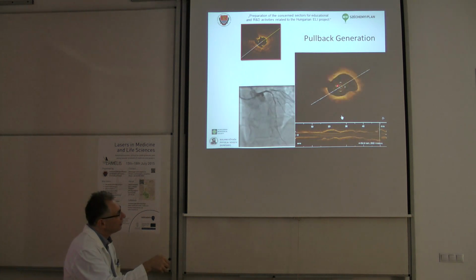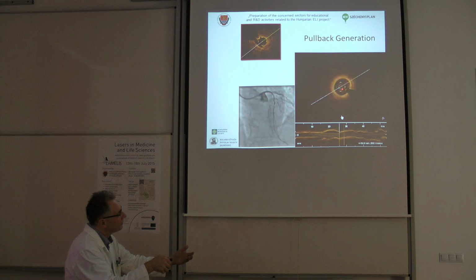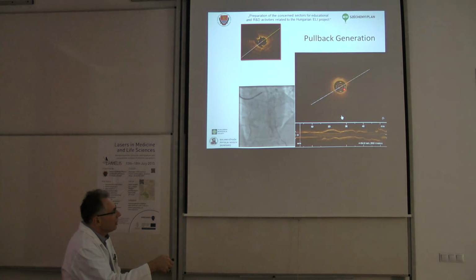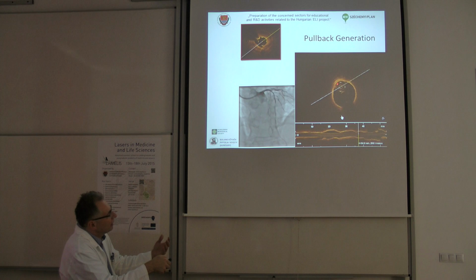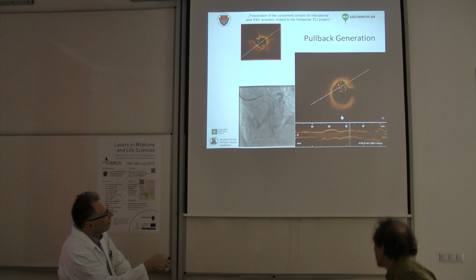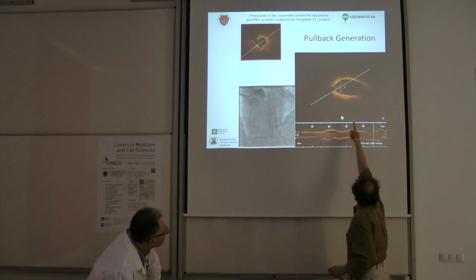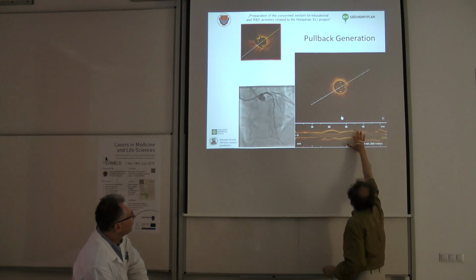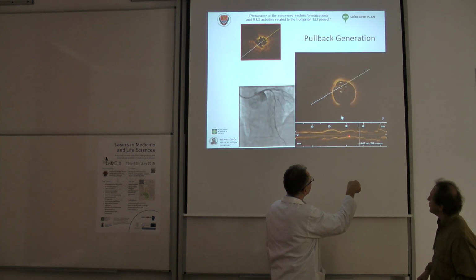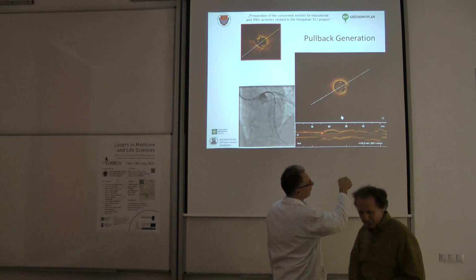So this is the plastic sheet, which is transmittable for the light. You cannot see the probe because the probe generates the image. The outer surface is marked, but it's electronically marked as a post-processing step. This is the tissue which you see here. And these horizontal lines are the outer surface of the plastic. This is the inner surface of the plastic.